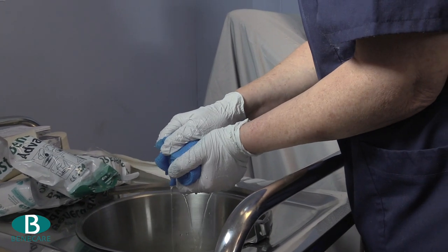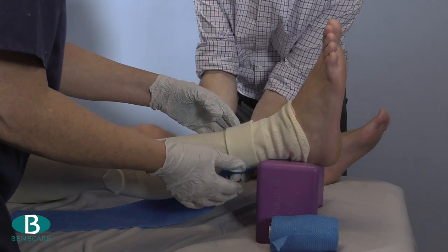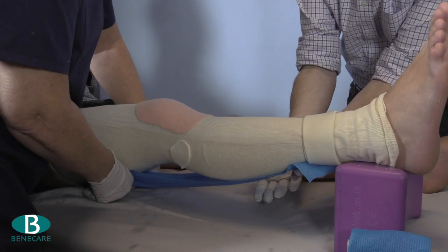Now dip the slab and the bandage into the water together. Position the slab onto the posterior aspect of the leg with slight tension.